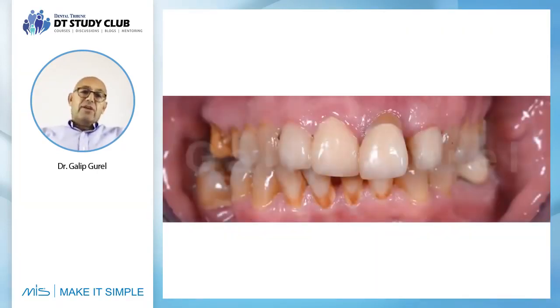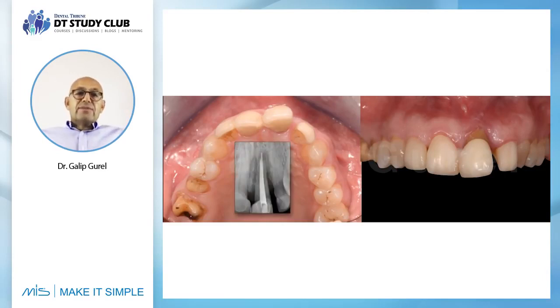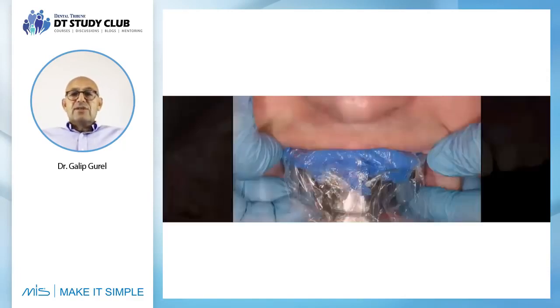Well, a very complex case. The patient comes to the office with this now other central, tooth number 9 or 21 in Europe, hypermobile. It was not really terribly infected, but it was hypermobile, and of course a part of it was due to his bite. He is a class 2 patient, and look at the rotation and the way it's protruding out. So there's almost no bone support left there, and we decided to extract it.